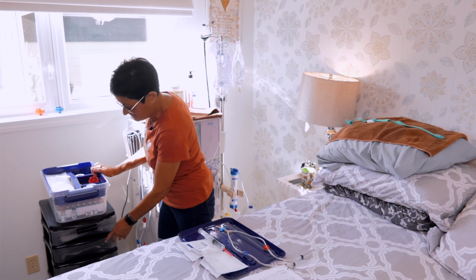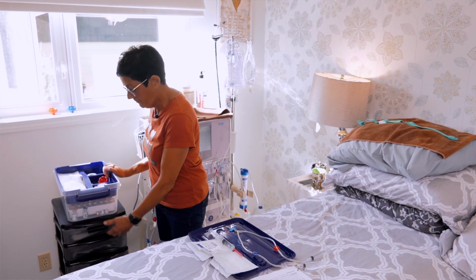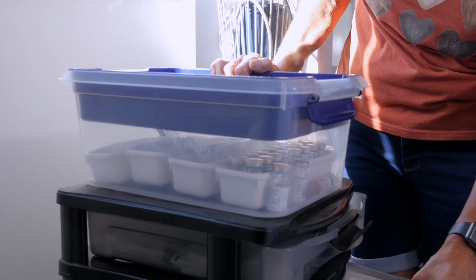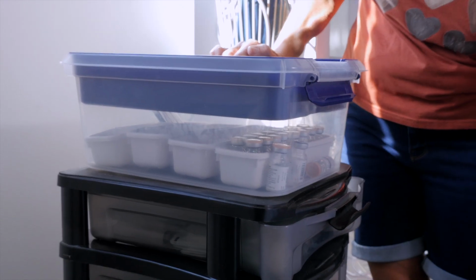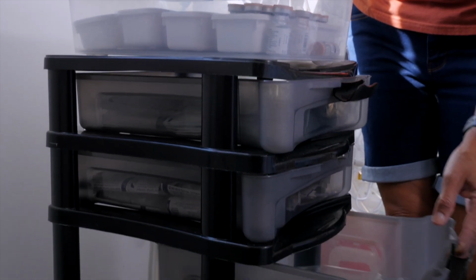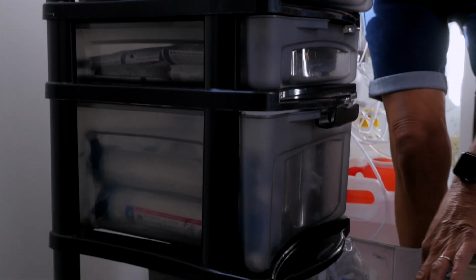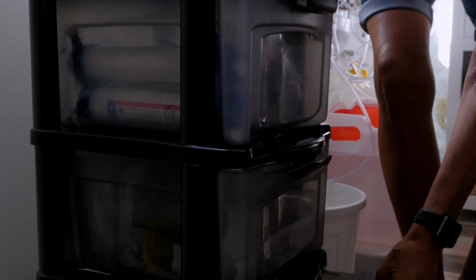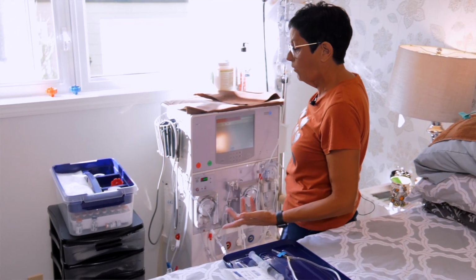These are all my supplies I need for 1 week. I usually fill it up. I have my syringe and my gauze, another drawer of the smaller syringes, all my dialyzers or artificial kidneys, my blood lines and the drain bags, and then my saline. So I usually stock that up weekly, and that'll be enough for 1 week.